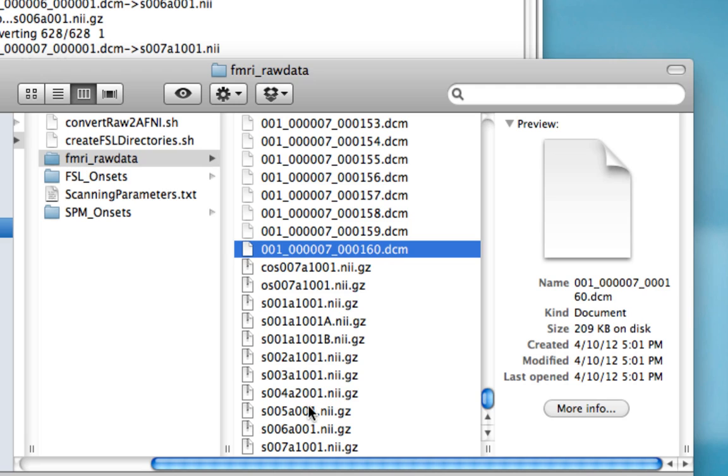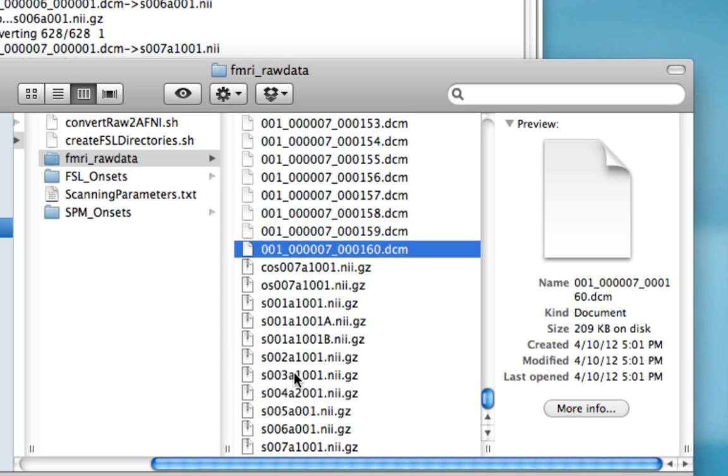The ones we're going to focus on in the future tutorials are five, six, and seven. The rest of these represent either redundant scans or images of the anatomical scan, or things like the scout scans, turbo flash, and field mapping scans.